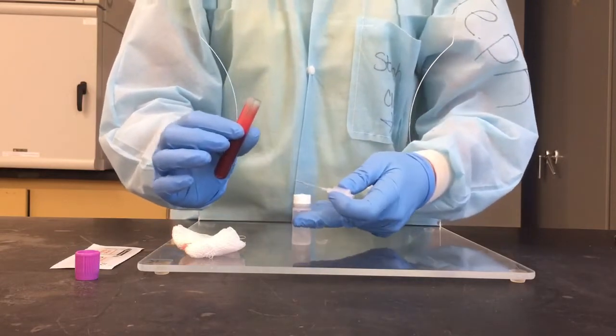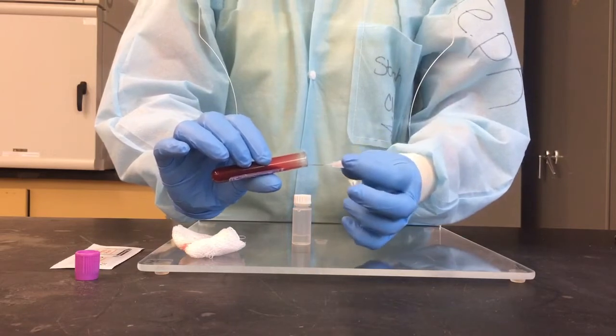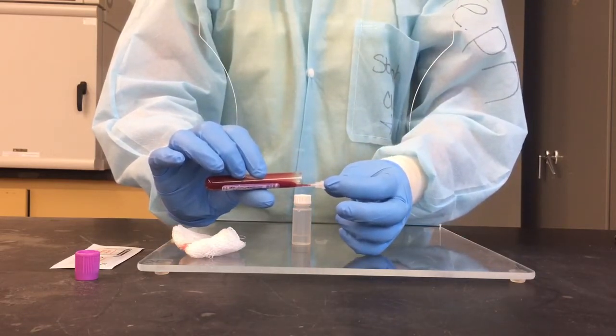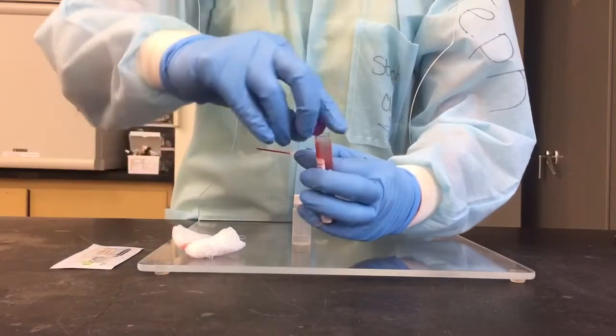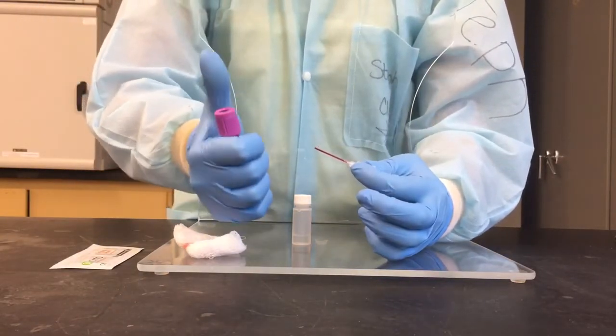So remember that when you fill your capillary tubes, you want to have both of these tubes pretty much horizontal. As you leave your tube in here, you'll notice that it will fill, but then it will just stop filling when it has hit 20 microliters. Recap your specimen. Make sure your cap is on there good and tight.